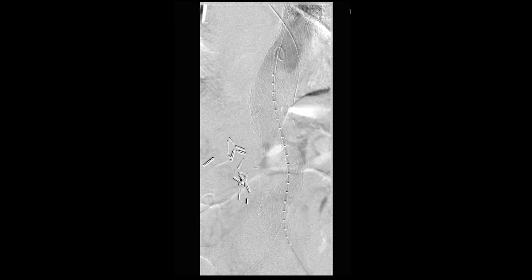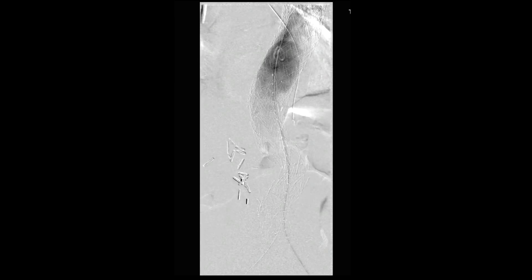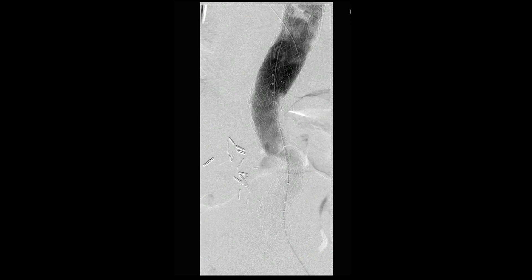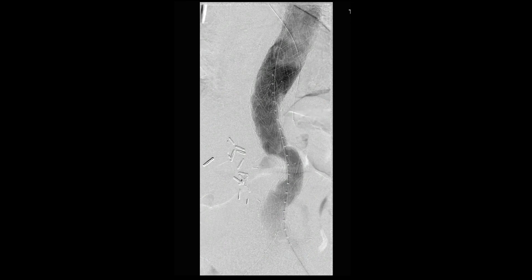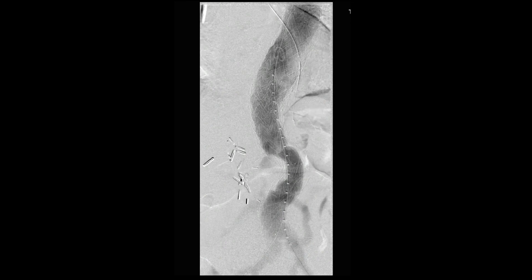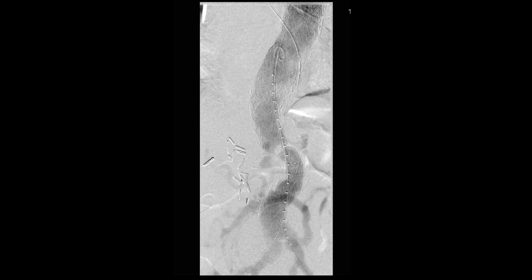This concludes our video demonstration of repair of a contained rupture of an aortobiiliac bypass graft.